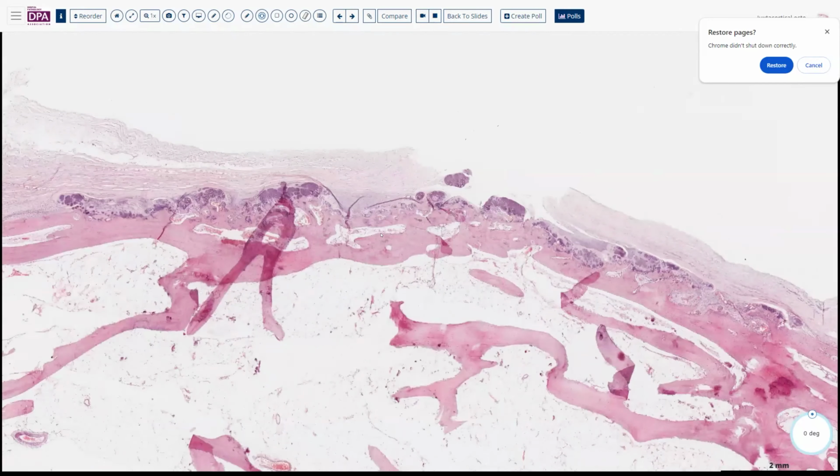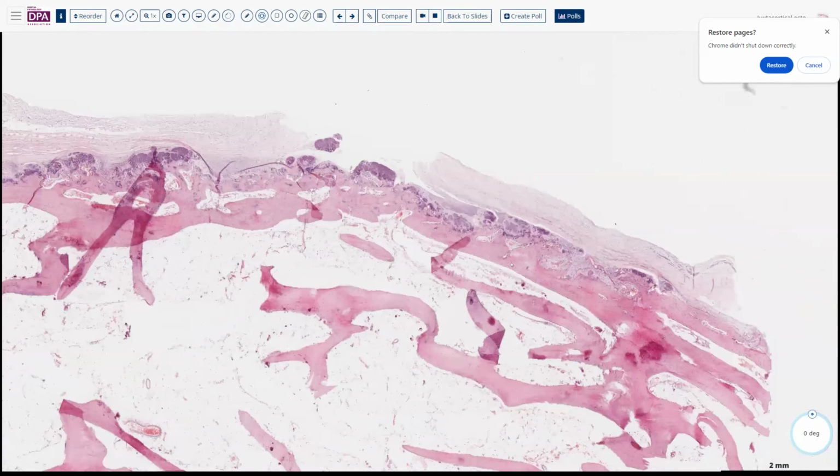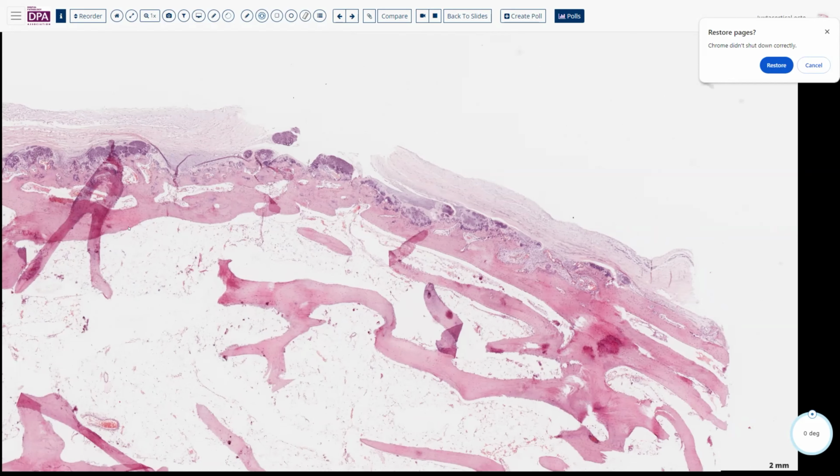This type of lesion in a flat distribution with just mild distortion of the bony architecture would be more difficult to diagnose radiographically. But typically, they have a normal marrow space connection to the underlying bone. And by removing this cartilaginous tissue, along with its associated bone, you essentially cause the lesion to heal over and no further problems are anticipated.